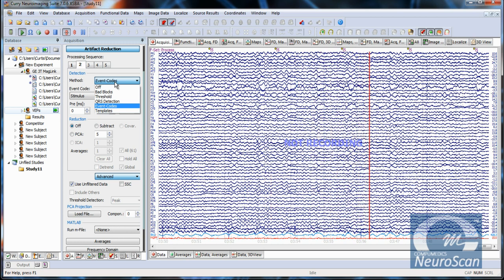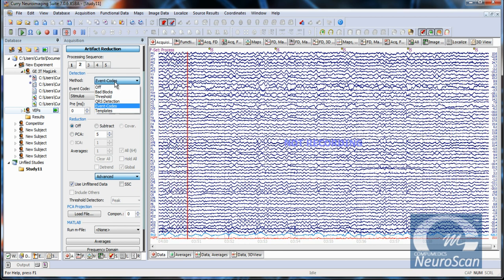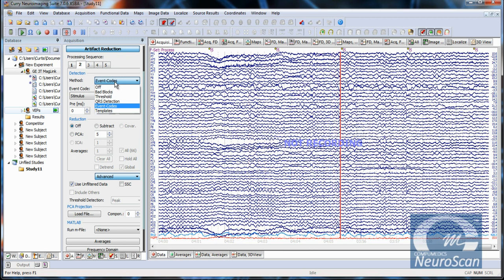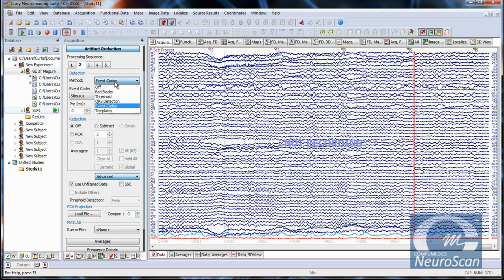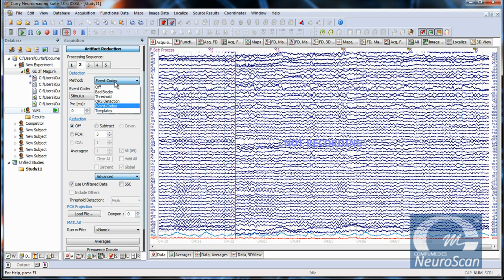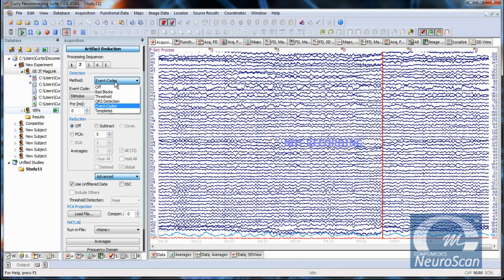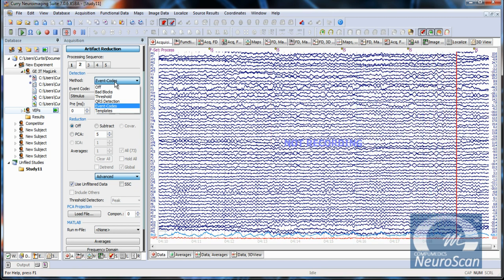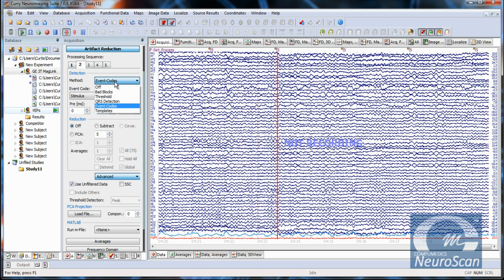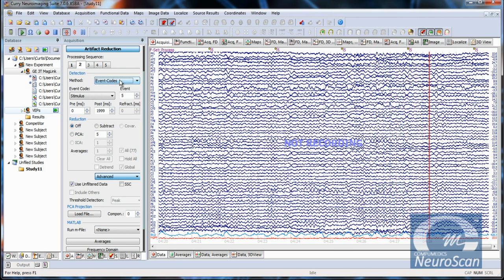Now typically with a MicroMagLink system, we can include a pulse oximeter. The pulse oximeter is placed on the subject, with slightly different timing, but since it's a fiber optic connection to the control room, it is essentially transparent to the magnetic field and gives us a very, very clean and consistent measure of triggering for the ballistocardiogram suppression. However, we can use the EKG signal. And I'm not going to do much correction to the EKG signal.